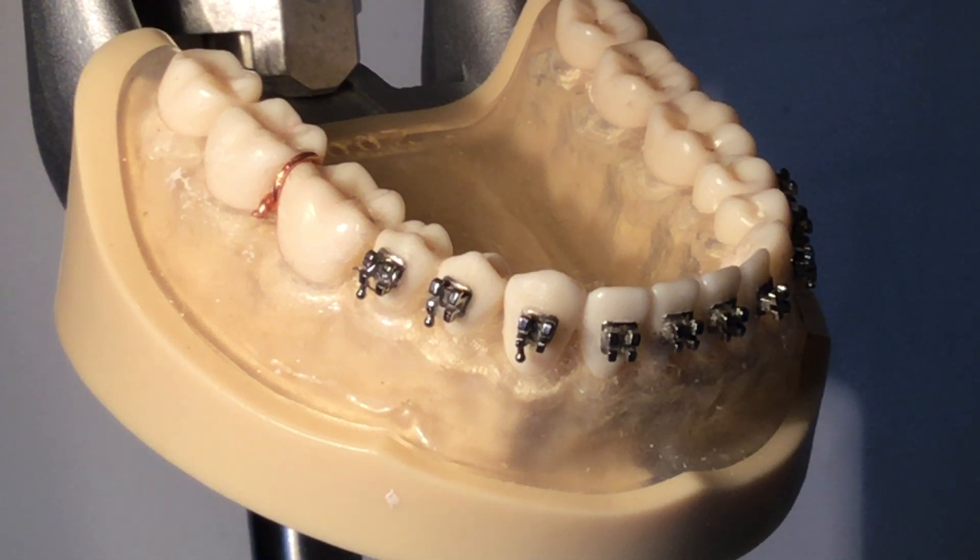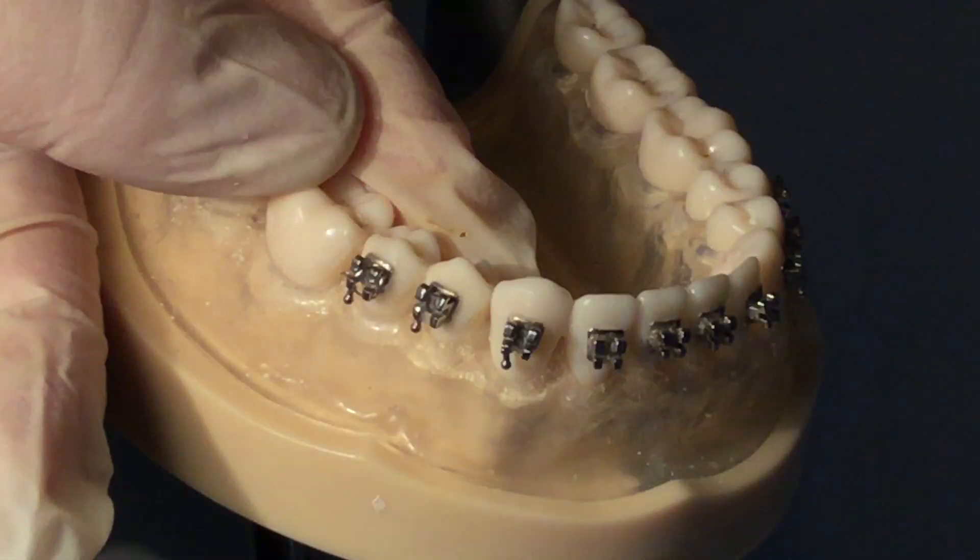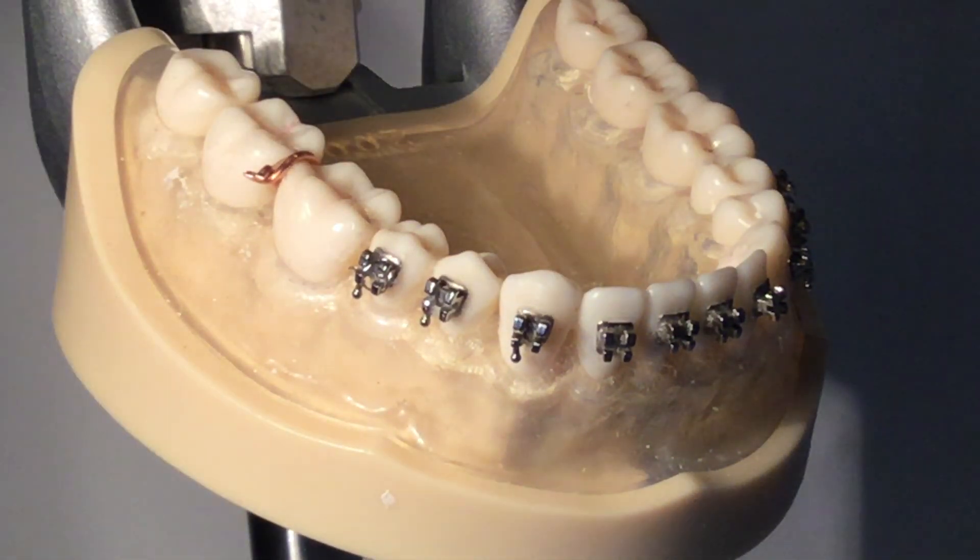To remove the brass wire separator, use a scaler to lift the pigtail from the interproximal surface. Cut the brass wire with the wire cutter.